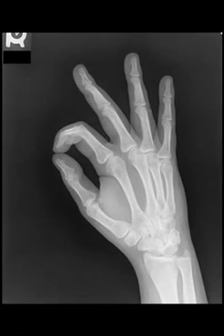Here is the medial oblique projection of the right hand. The anatomy that's visualized on the PA projection is still visualized on the oblique projection. However, we get a slightly different orientation. You'll notice now that we can see the ventral portions of the metacarpals and phalanges.